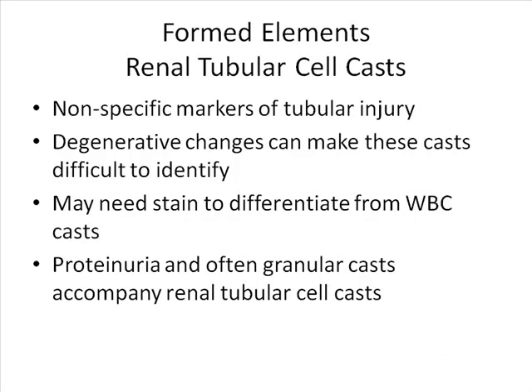You can also have some renal tubular cell casts. You can have epithelial cell casts stuck once again in that matrix. But they're showing too that you have tubular injury. Remember, those cells are only a unilayer coming off of the tubule, and if they're sloughed off in high proportions, you know that you're having some tubular damage going on.